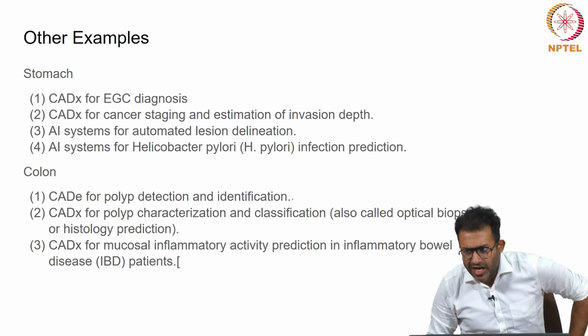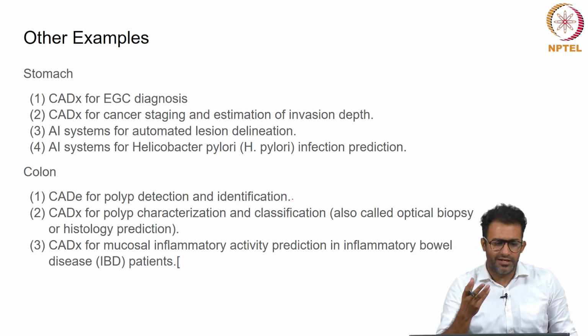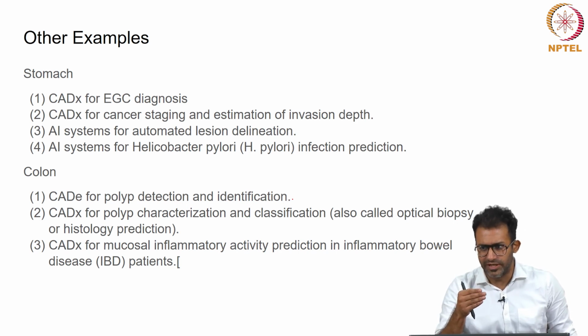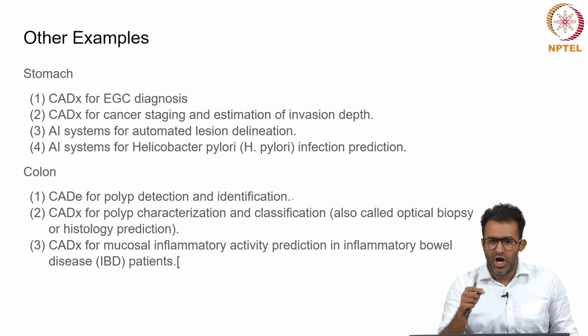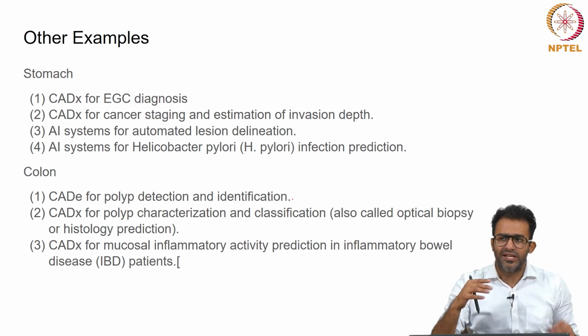So, there are a huge number of advantages. What we saw was just one example of how you can use artificial intelligence and DL/ML in understanding and helping early diagnosis. The benefits are pretty high. If you detect an esophageal adenocarcinoma earlier on, you are able to perform a surgery, you are able to avoid sometimes life threatening palliative chemotherapy, you are able to remove only that lesion and escape doing an esophagectomy.